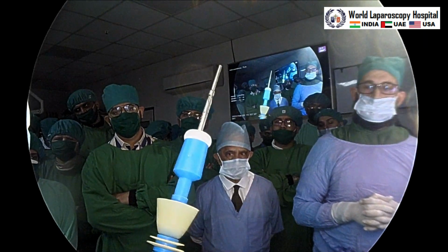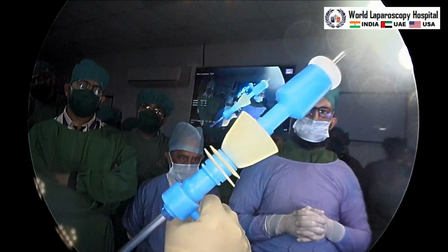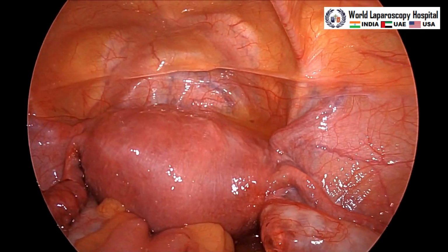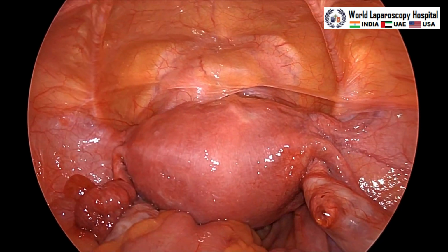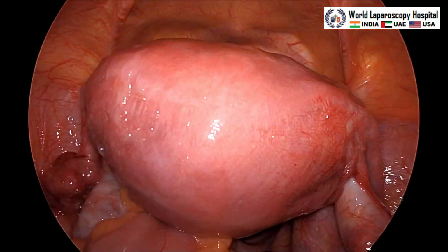This is the uterine manipulator. This is the Mangeshkar uterine manipulator which will be introduced. This is the fulcrum of the uterine manipulator, and we are using a 3.5 centimeter colpotomizer with the tenaculum, and that will be introduced, and the uterus will be anteverted with contralateral traction. We can see both ureters are nicely visible, and you can have a look. Anteversion of the uterus will be carried out.